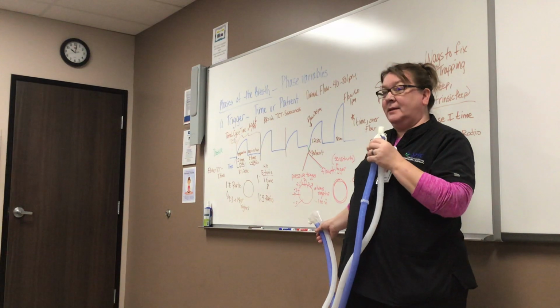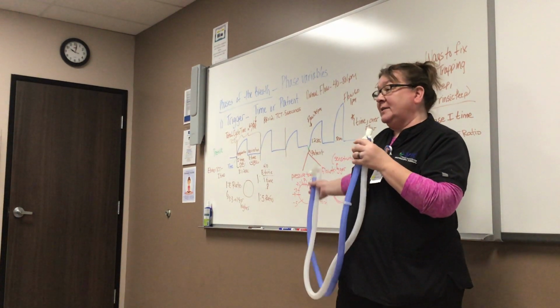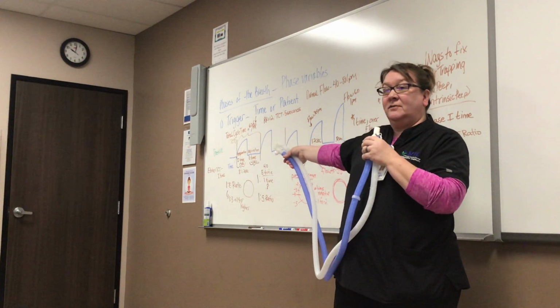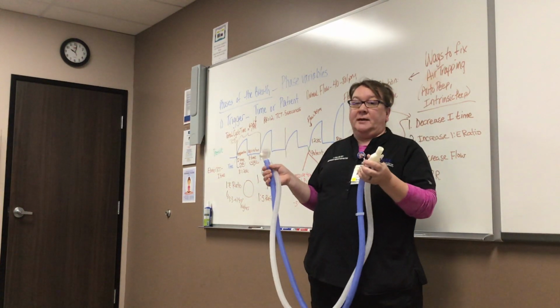It looks instantaneous to you. You're not on the ventilator. But to a patient on the ventilator, it can seem like a long time because they've got a trigger. It's got to go all the way through the circuit, sense it at the ventilator, and now my breath comes back. So that's why pressure triggering is disfavored.